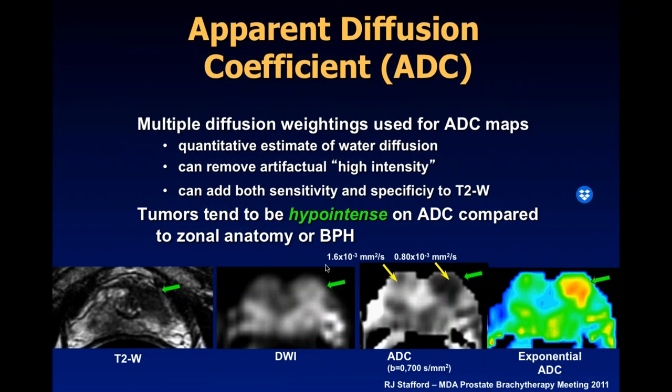And we are going to have to ultimately become more comfortable with understanding and communicating about MRI. There's a nice review of the obstacles and opportunities in order to learn about the utilization of MRI. And there's about 15 articles in the most recent Brachytherapy journal that I encourage you to review, because it walks you through anatomy, MRI, all of it for the radiation oncologist, and really the terminology and bringing yourself up to speed, because MRI is going to be an important component, not just of prostate cancer, but all of radiation oncology.